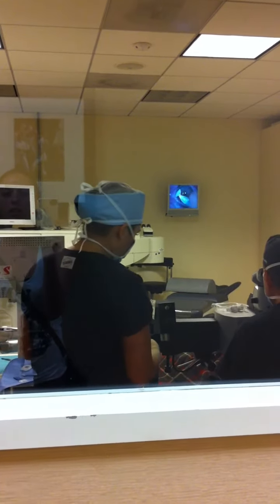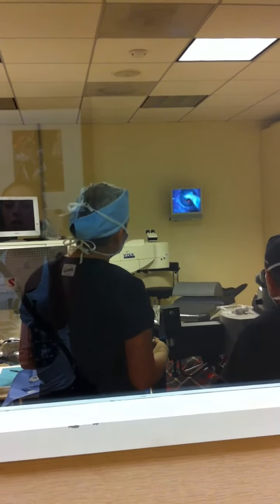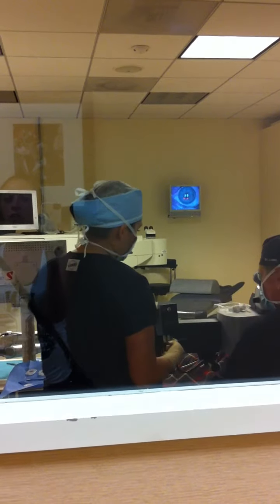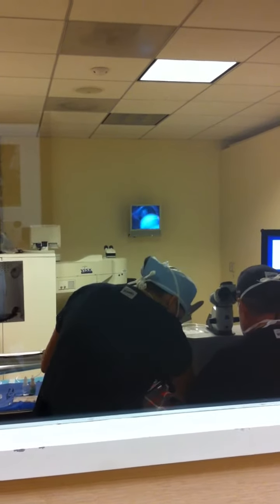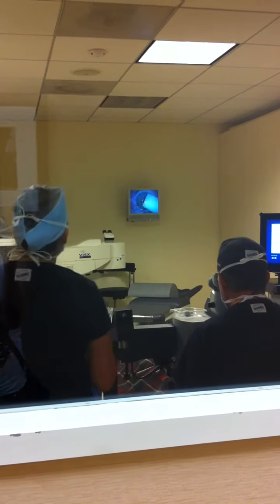So the eye doesn't really have any nerves, does it? It really does. It does? Yeah, they did flood his eye with anesthetic. Okay. Liquid anesthetic. So that'd be why. I think it's like pound for pound the most sensitive tissue in the body. Even more than getting kicked in the balls? Uh-huh. That would not hurt as bad as if you got something in your eye. Okay, so it's flooded with anesthetic. Yeah.